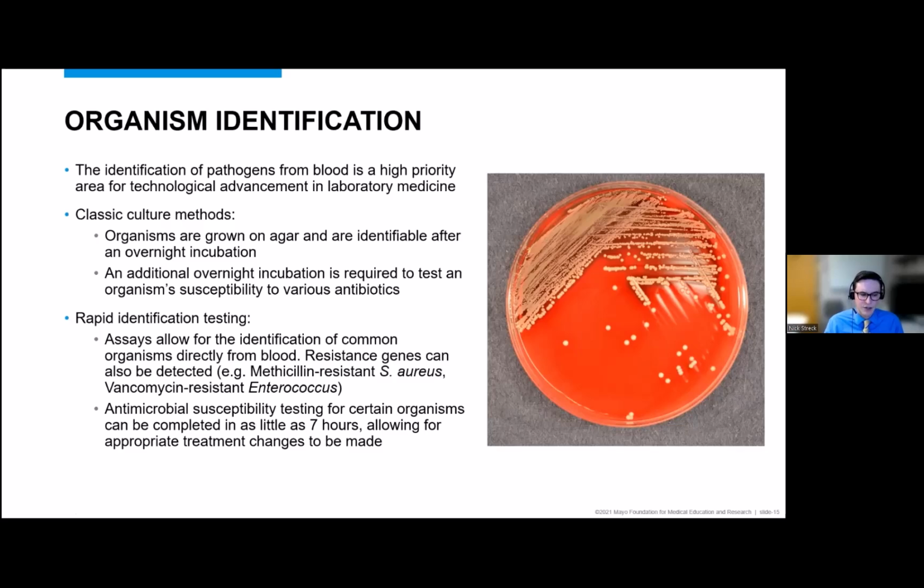After identification, we can then do further testing for susceptibility testing results to let the healthcare providers know the susceptibility profile of these organisms. That takes at least another incubation day to perform this testing. So anywhere from about 2 to 3 days, using our classic culture methods, we're able to provide both the identification and susceptibility profile of the organism that we've identified in the laboratory.